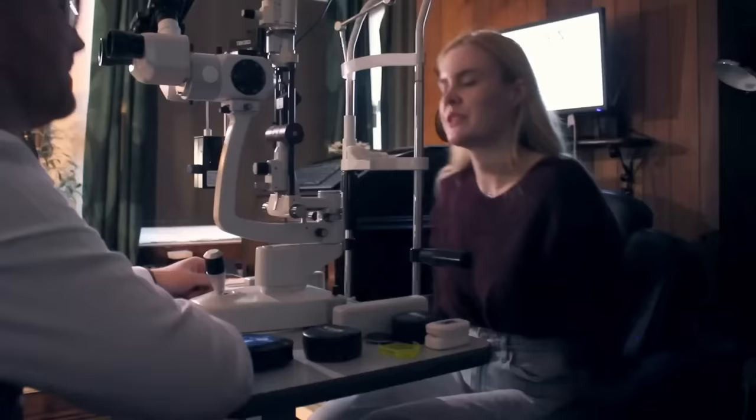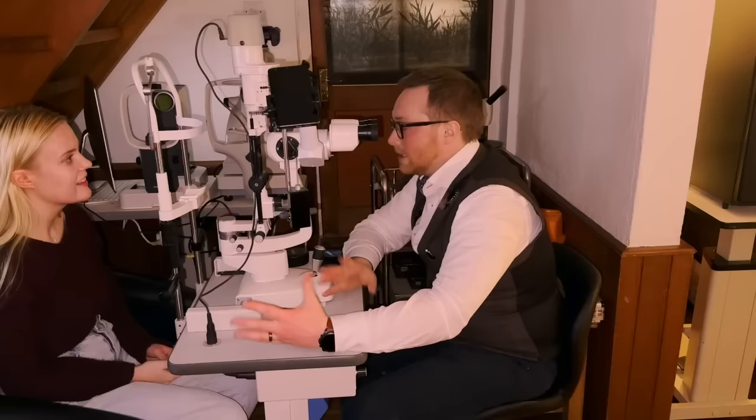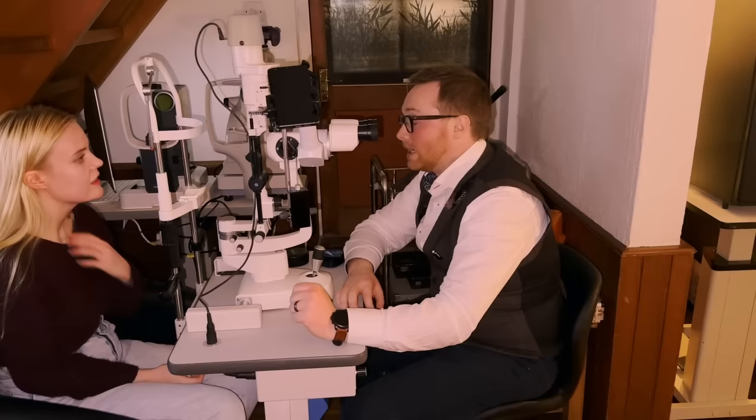Yeah, we tend to look at your eyes under a microscope. So yeah, it's just an accumulation of pigment on the white of your eye. It's there, all absolutely fine. There's no sort of warning signs I can see with it. But it's good practice, if it's not been noted before, we can get an image. Yeah. Take it again when you come for your next eye exam and just see if there's been any change.